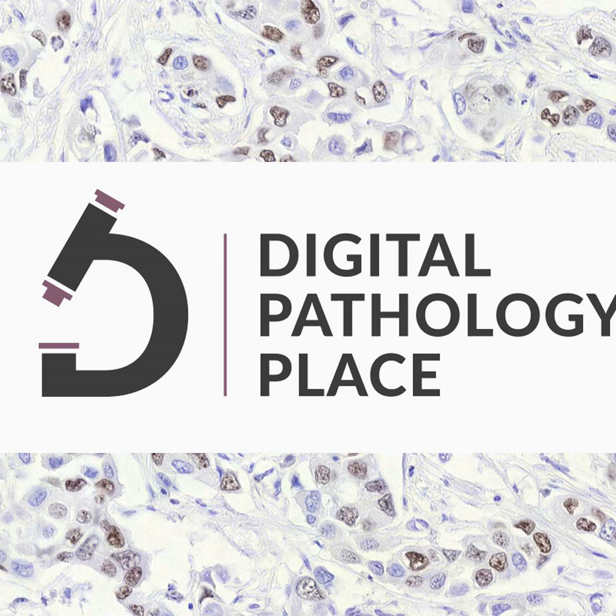Yeah. So I think it's very important for us because as we look at it, if it's not standardized in a manner, it doesn't matter how we digitize it, you're going to have variations in it. These variations create downstream impact to analyzing the tissues to actually getting useful insights out. So ensuring that it's stained properly is absolutely critical for us.